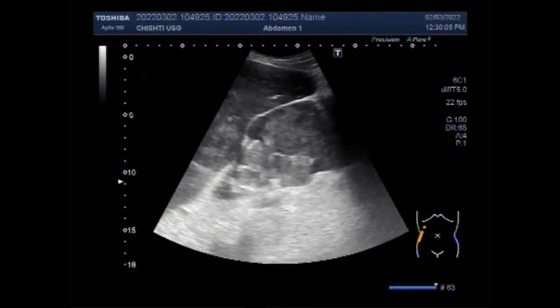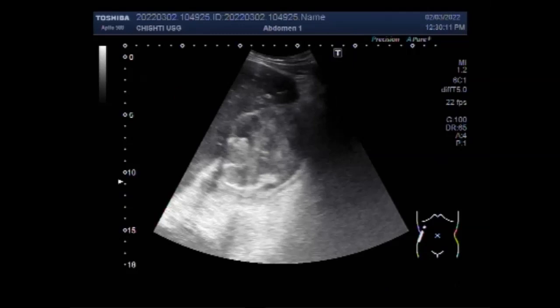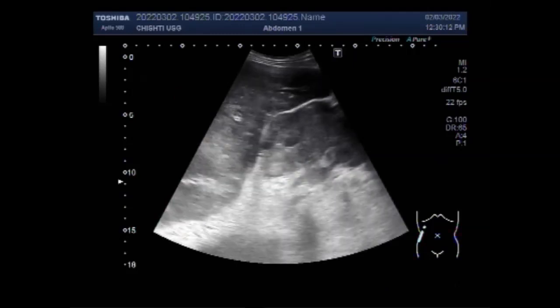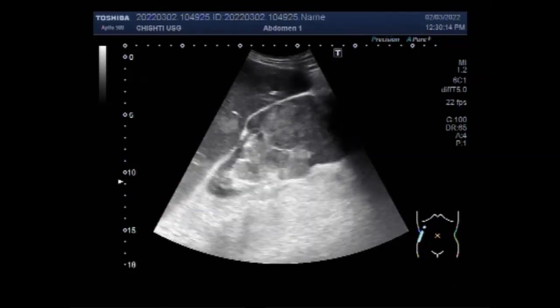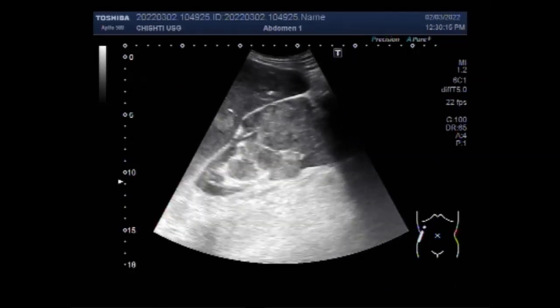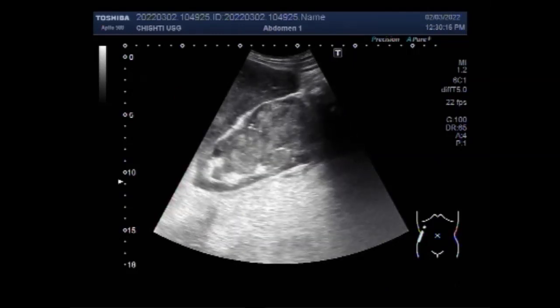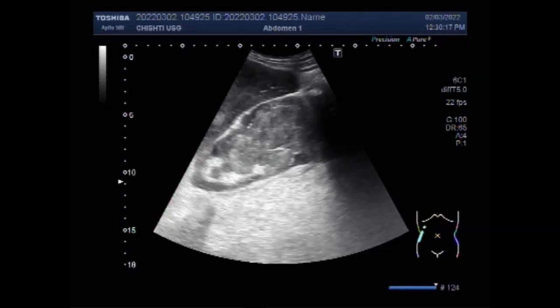Dear viewers, I hope you are all fine. This ultrasound video shows a large renal mass with a large hepatic mass.